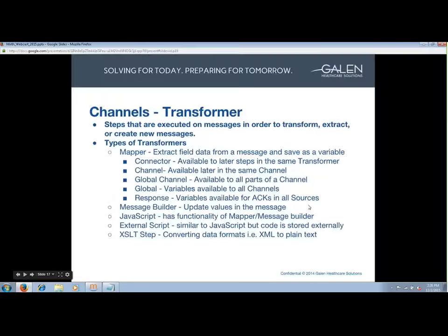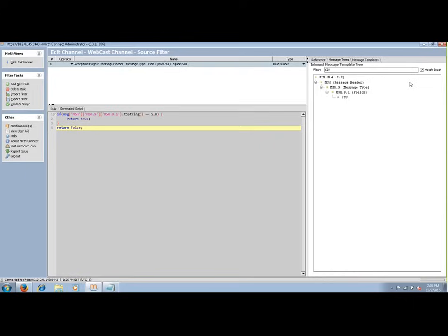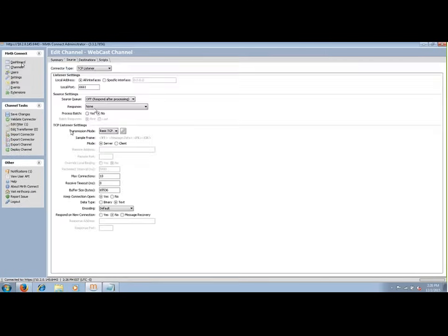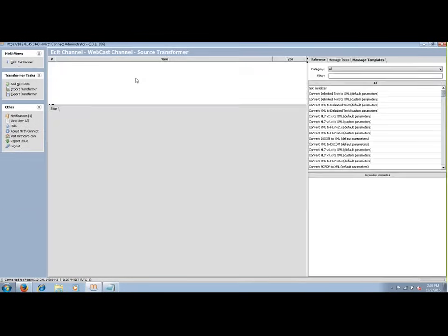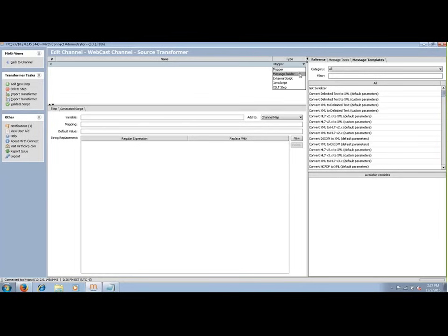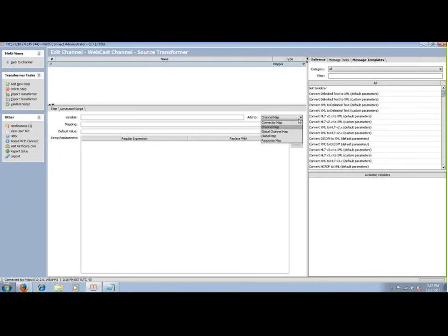Next up, transformers. Transformers are steps that are executed on messages in order to transform, extract, or create new messages. There are a couple different types: mapper, message builder, external script, JavaScript, and XSLT step. Mappers are used to extract field data from a message and save it as a variable. We have multiple variable scopes: connector variable, which is available to later steps in the same transformer; channel map, available later in the same channel across multiple destinations; global channel map, available to all parts of the channel including source, response, and scripts.